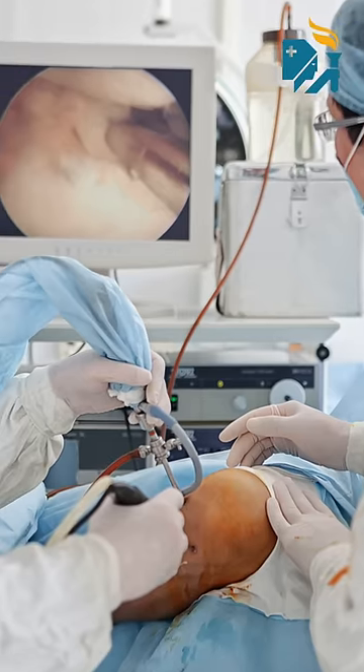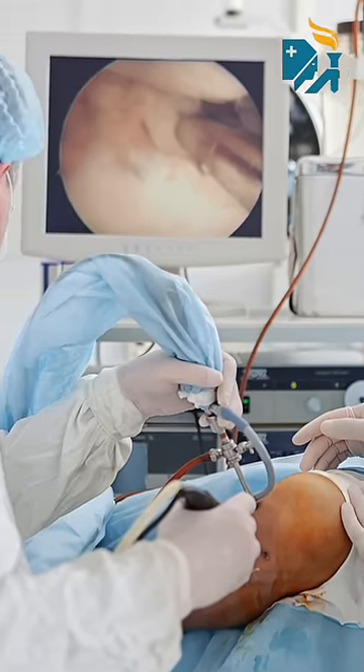With arthroscopy we can diagnose the condition of the joint inside, and at the same time we can treat these conditions also.